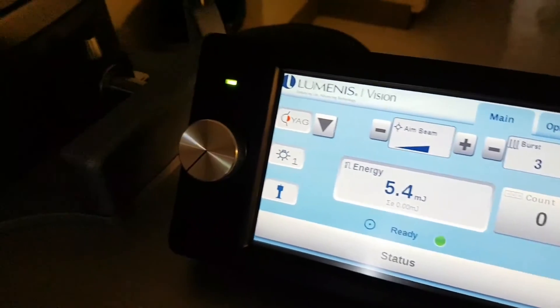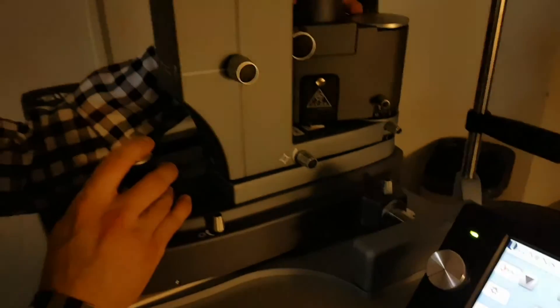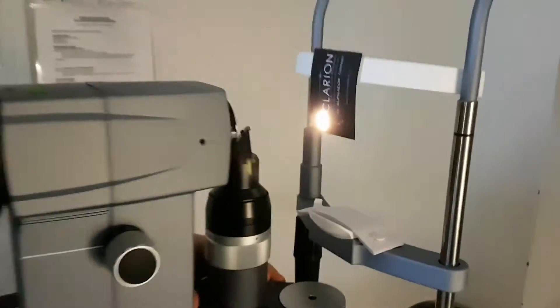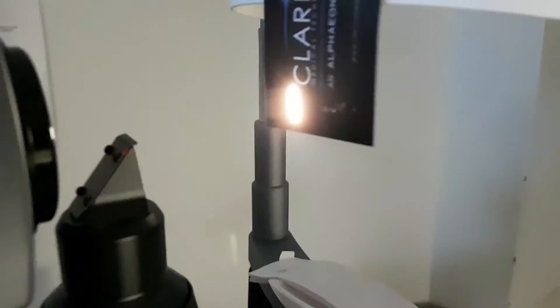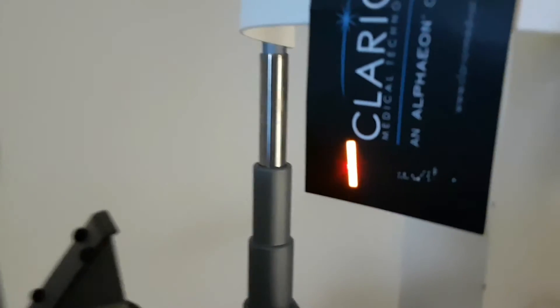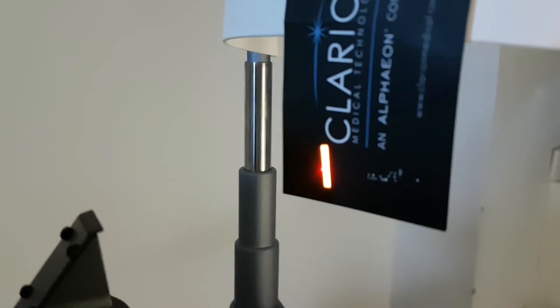When you're starting to treat, you'll see the shot count. We can look at that here.